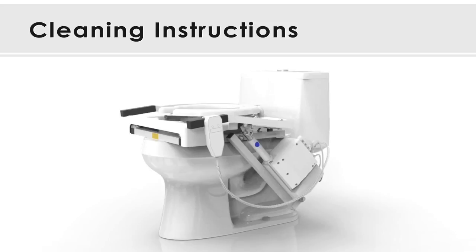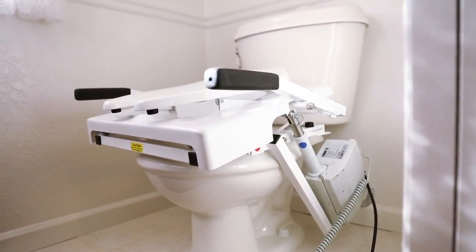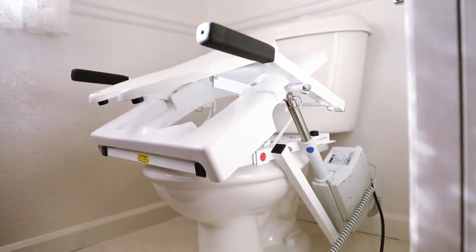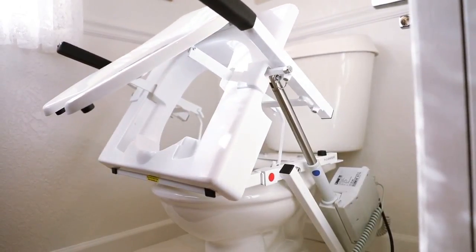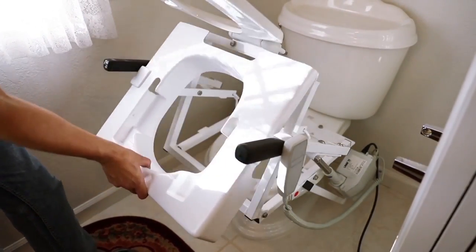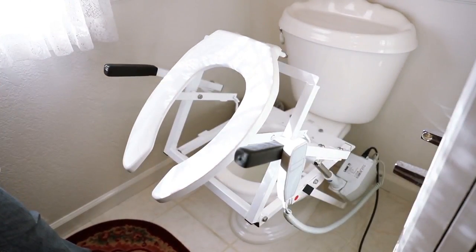For cleaning instructions, you can follow a few simple steps. Using the push button control, raise the tilt into its up position. Lift the toilet seat up and grab the front of the shield. Pull upward then forward until the shield slides off of its frame. Use a soft cloth with warm water and mild soap to wipe the shield down. Refer to the instruction manual for further cleaning details.